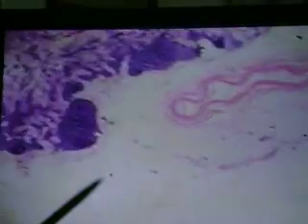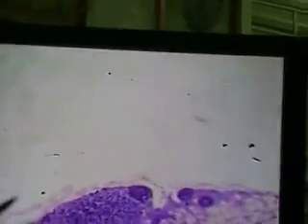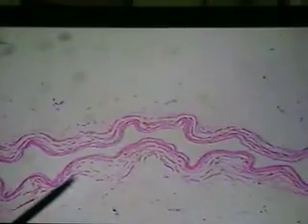Let me look at another slide. Okay, so there's a lymph node right here. These are the mesenteric vessels right here. That's a nice example of the lymph node. And once again we see the vein, but this is a better looking vein. And as you can see, we see the artery, with a lot of sympathetic nerve fibers close in relation to it.